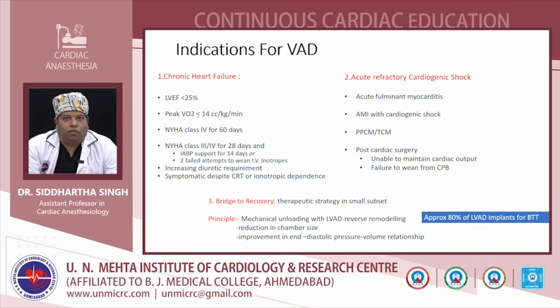Other indications are bridge to recovery, like a therapeutic strategy in small subsets. In most of the cases, LVAD is implanted as a bridge to transplant. The principle is mechanical unloading by the LVAD, which reverses the remodeling, reduces chamber size, and improves the end diastolic pressure volume relationship.